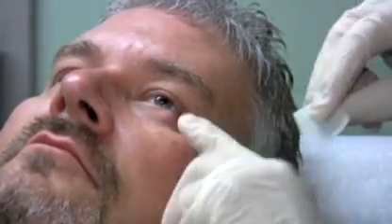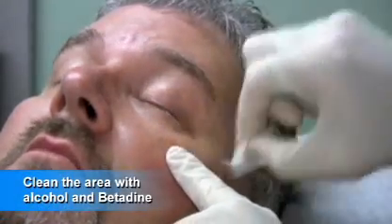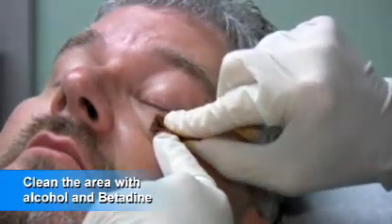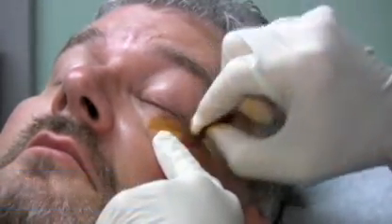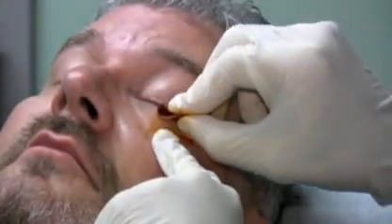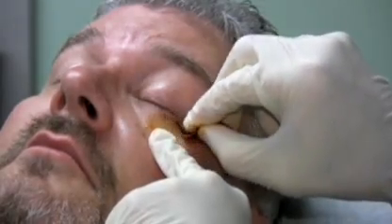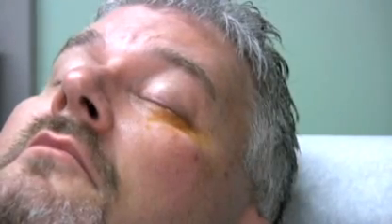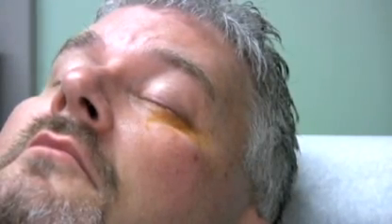I'm going to prep with alcohol and then betadine to kill any germs that may be present. On that second pass of betadine — we're going to inject through the outside of the eyelid. There's no reason to go through the conjunctival surface.